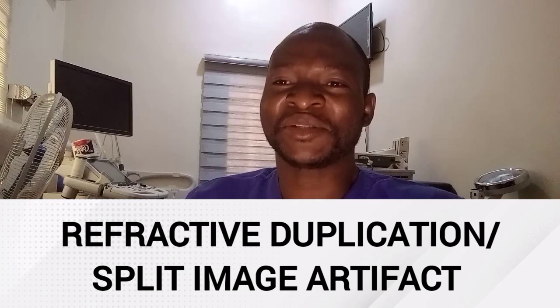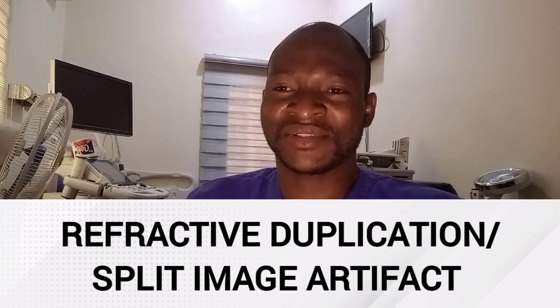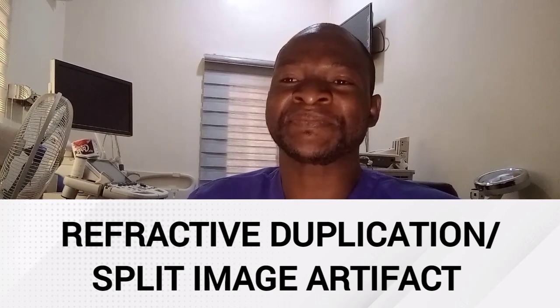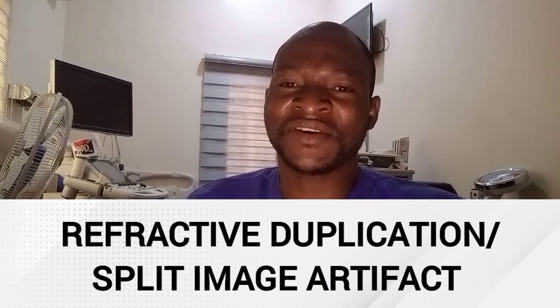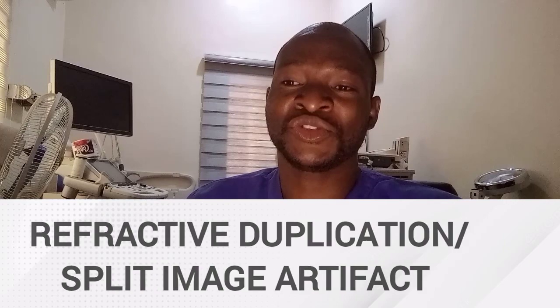When the beam is pointed to the right, the sound may be refracted backwards, back towards the midline by the oblique interface between the posterior aspect of the rectus abdominis and the triangular fat part behind it. This causes the superior mesenteric artery image to be shifted towards the right.